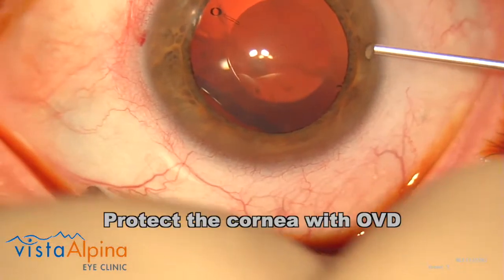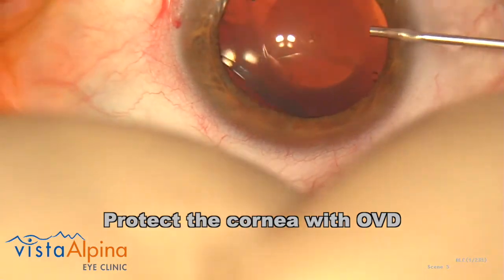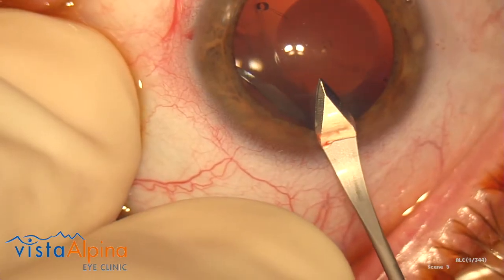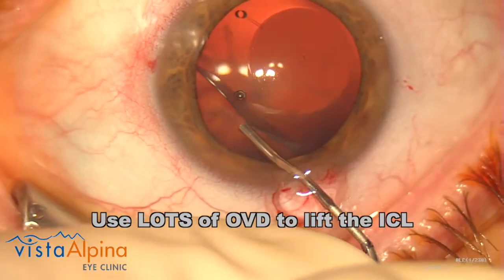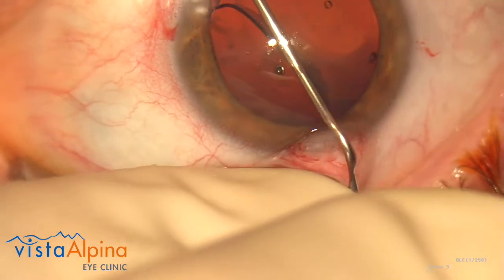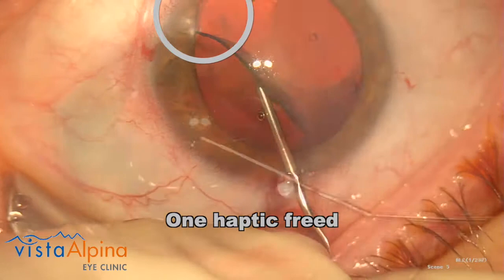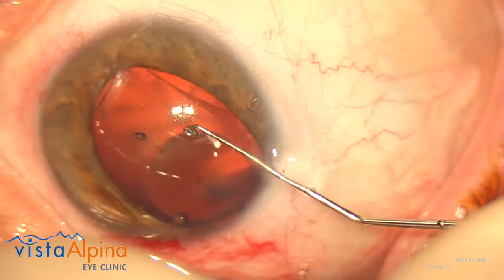A cohesive OVD is used to create space in the AC and to protect the cornea. We like to lift the ICL into the AC with the OVD cannula. In order to prepare for ICL removal, 2 or 3 haptics are placed in front of the iris.